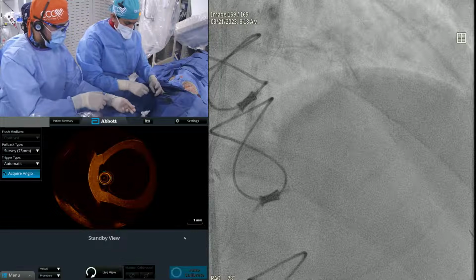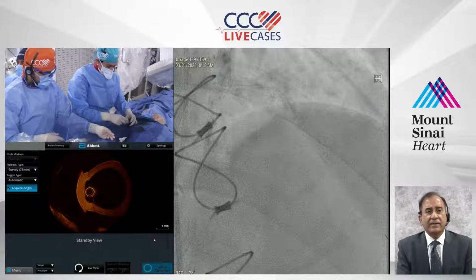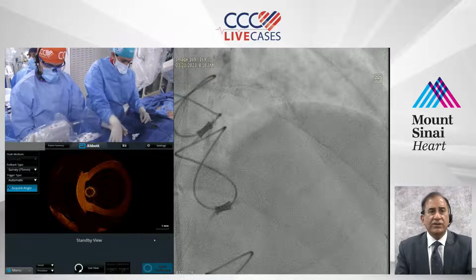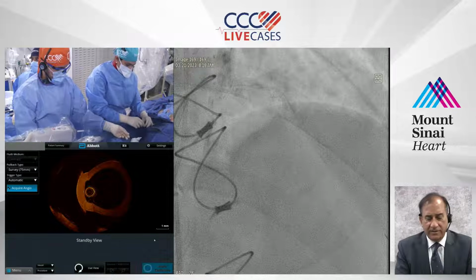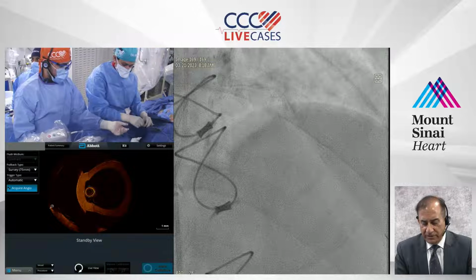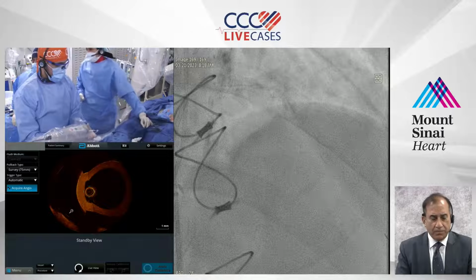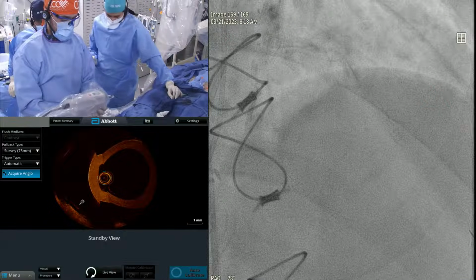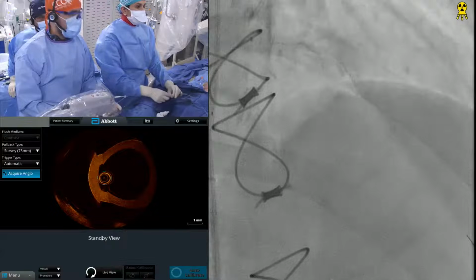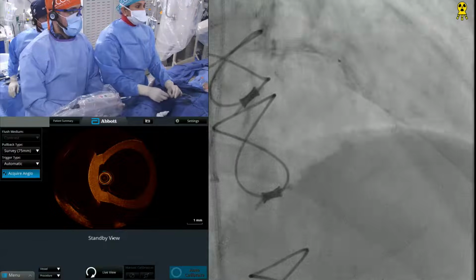In this particular case, because of a somewhat protected left main, you normally stay away from the left main with OCT, but this is a slightly different situation, which is what somebody has just asked also. The same thing applies to the IVUS criteria of left main significance. For IVUS, some people say 5.5, some will say 6. But what is the OCT lumen?